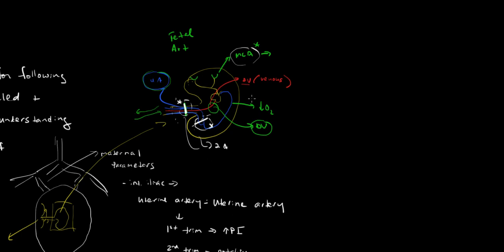So that's the fetal arterial circulation. The other thing that could be followed is the fetal venous circulation. And the portion of the fetal venous circulation that follows is the flow within the ductus venosus. And one could look at the flow waveforms within the ductus venosus.